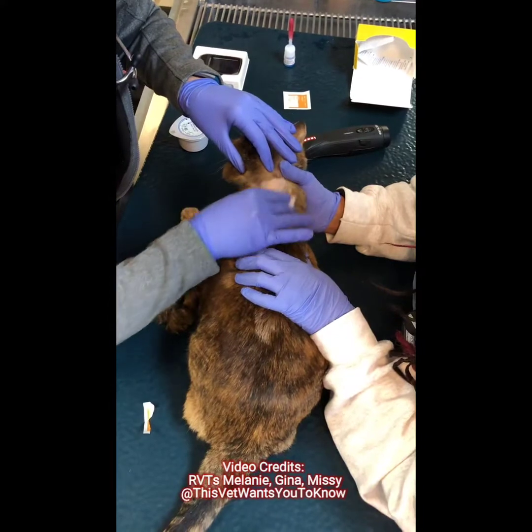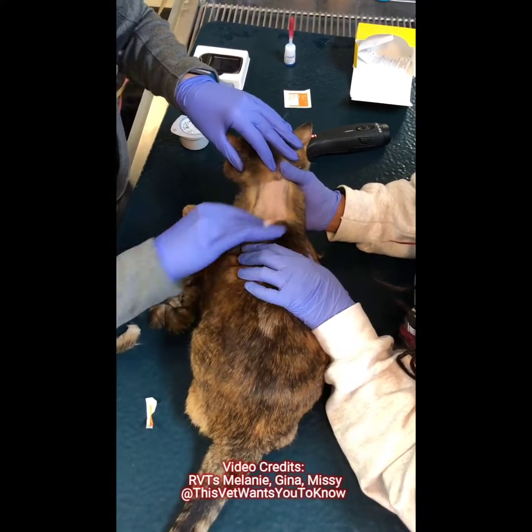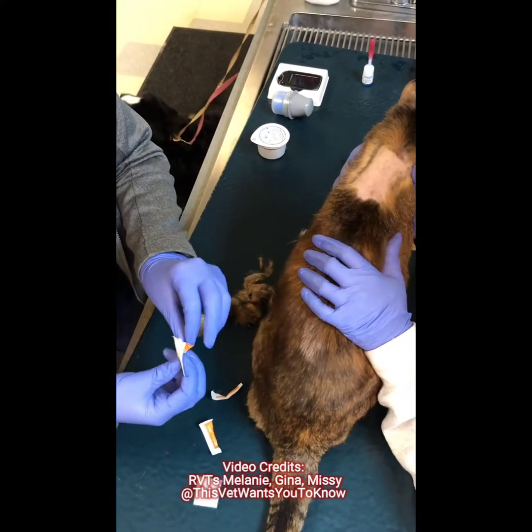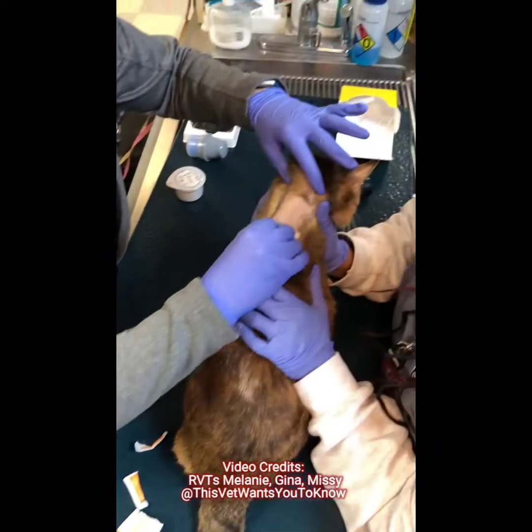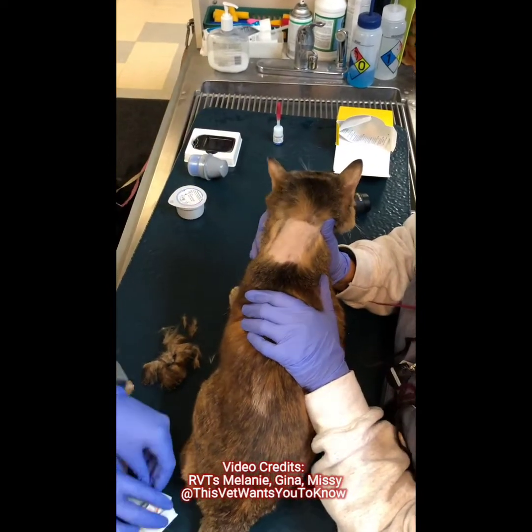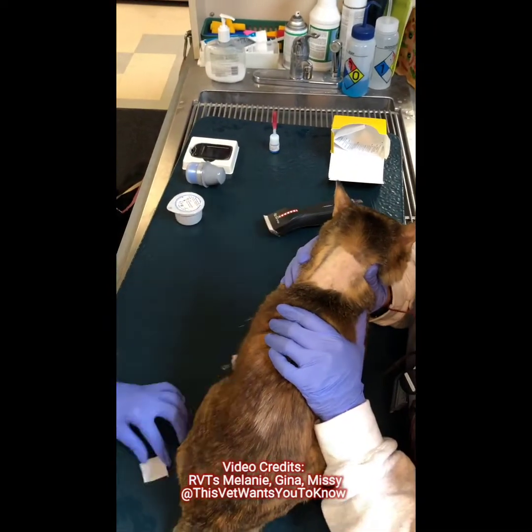That's a good girl, she's being very brave. Good girl. Okay, so then we're going to put the FreeStyle together.